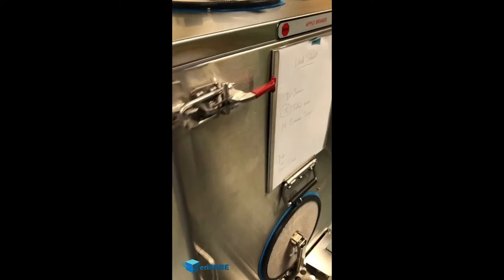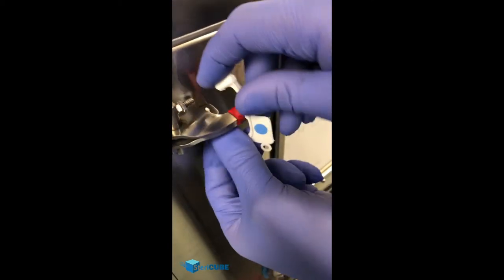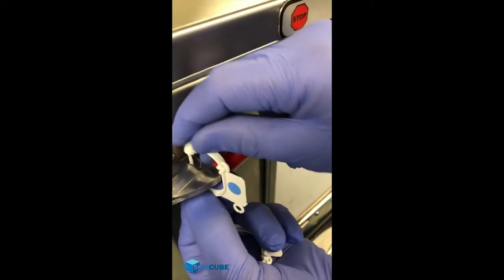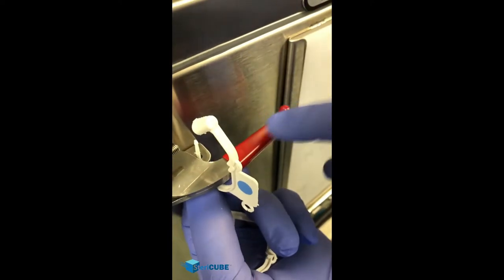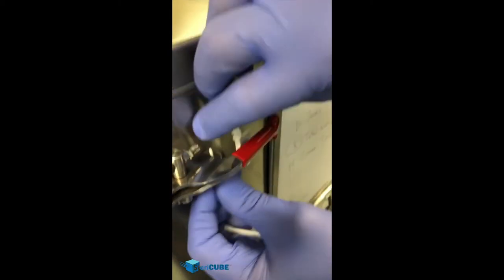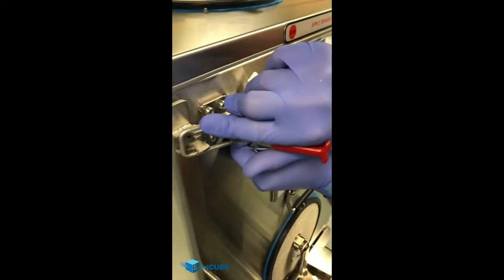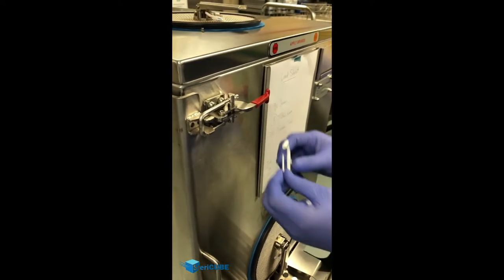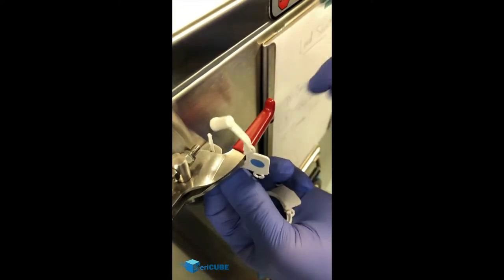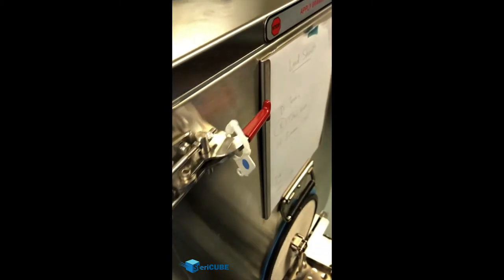Once we do that, we're going to put our integrity locks on it. What you want to do is come up from the bottom, go through the top with the blue dot out so that you can see it. Note that it's got to be around this handle so that it can't open. If you were to put it behind this handle, you're going to be able to open that up, which could compromise the load. We don't want that, so make sure you come up from the bottom, blue dot out, around the handle, and put that integrity lock in place so that we know it's not tampered.